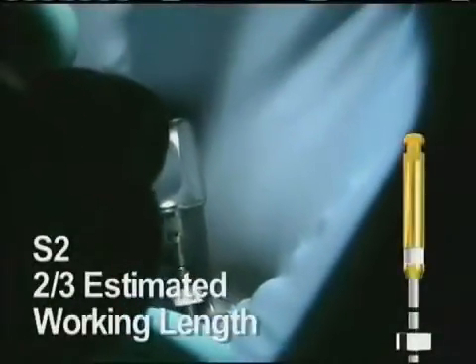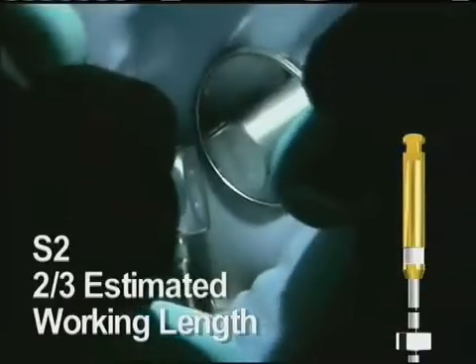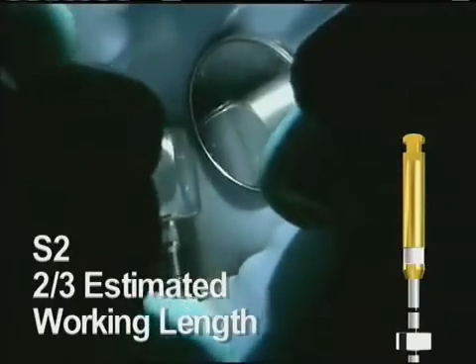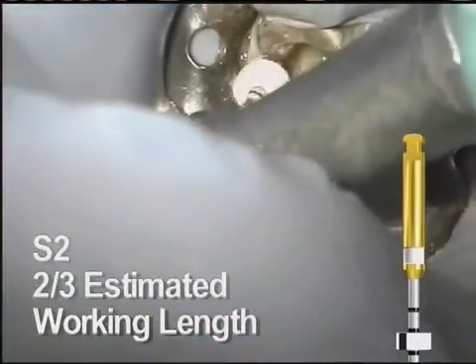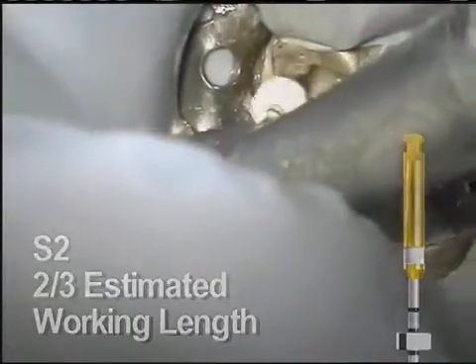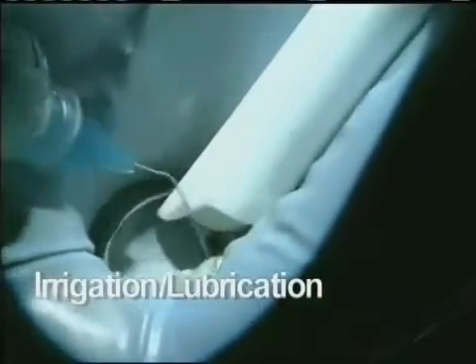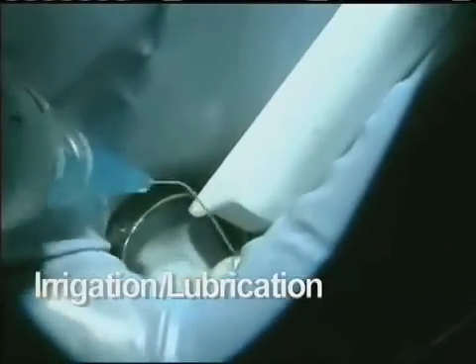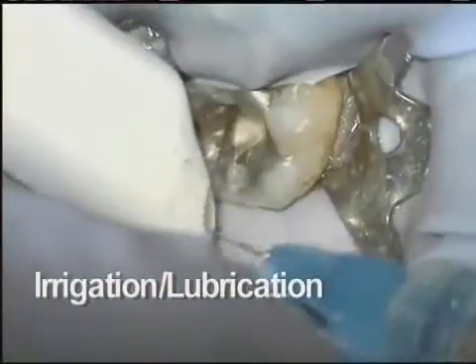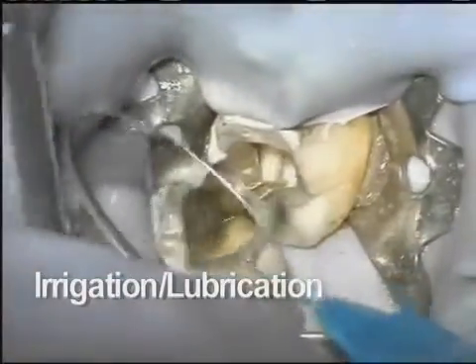Shaping file 2 is next. It goes to the same depth as the S1. While it may not always be necessary, the S2 can also be used in a brushing fashion. Here it goes easily to the predetermined limit. Throughout the procedure, use of sodium hypochlorite and a lubricant such as ProLube is strongly suggested. These help by digesting tissue and clearing the way for files as they work their way down the canal space.